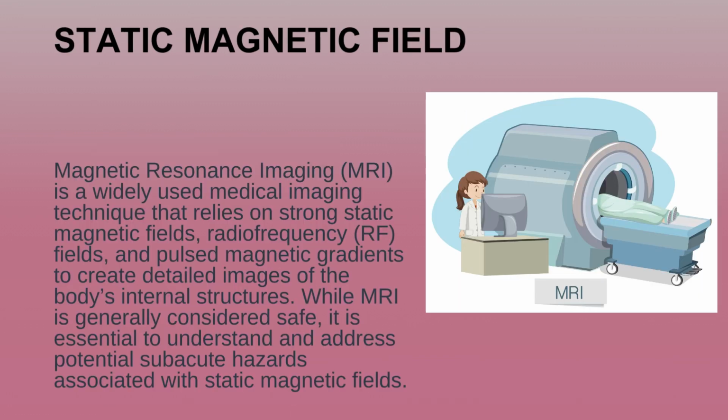MRI is a widely used medical imaging technique that relies on strong static magnetic fields with radio frequency fields and pulsed magnetic gradients to create detailed images of the body's internal structures. While MRI is generally considered safe, just because it's not using any radiation, there is still a hazard behind it. It is essential to understand and address potential subacute hazards associated with static magnetic field.